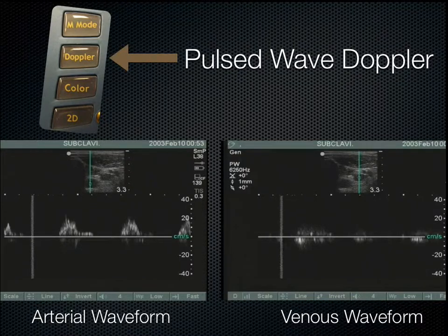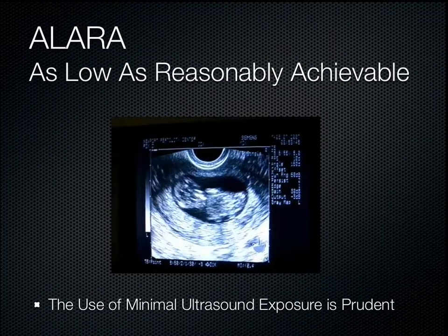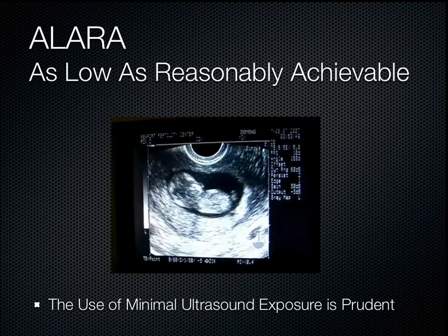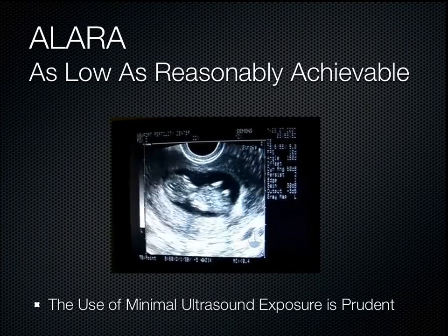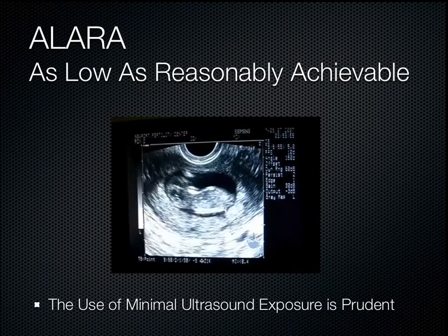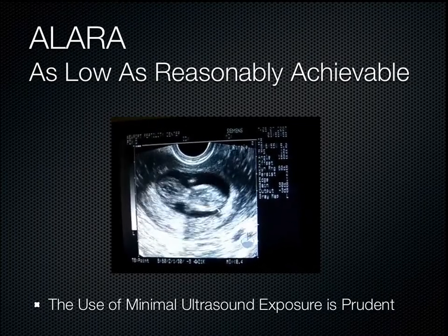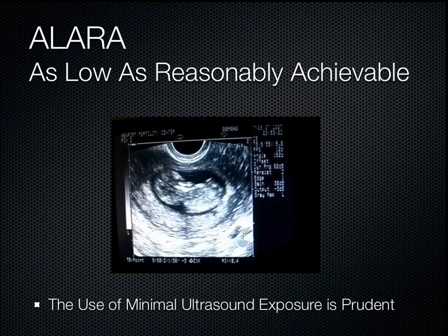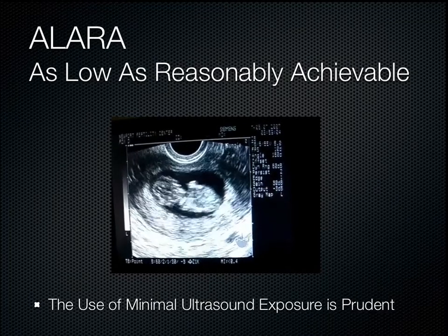Now, what about the concept of ALARA? ALARA means as low as reasonably achievable, and it's a holdover from other types of imaging modalities in which radiation or gigantic magnet is used, and you want to expose the person to as least amount of radiation as possible. And some could be said about ultrasound. The minimal use of ultrasound exposure is certainly prudent.